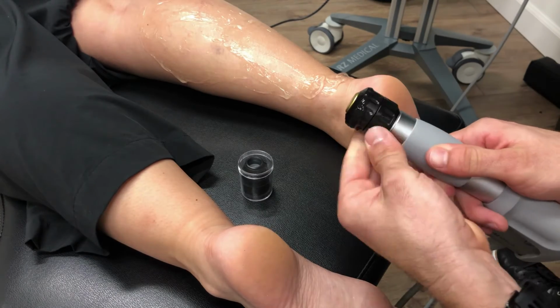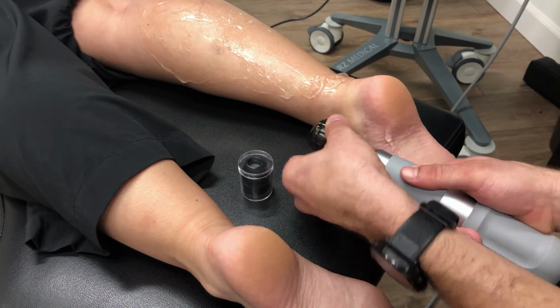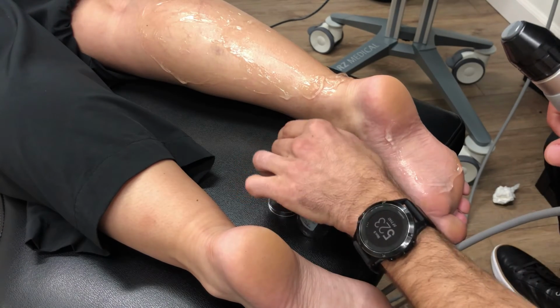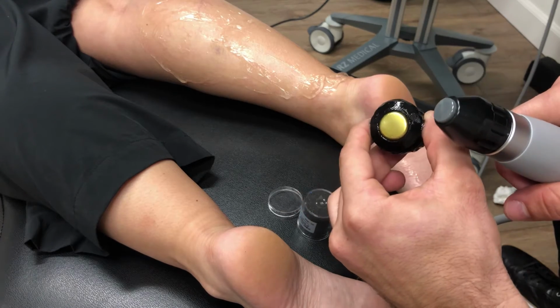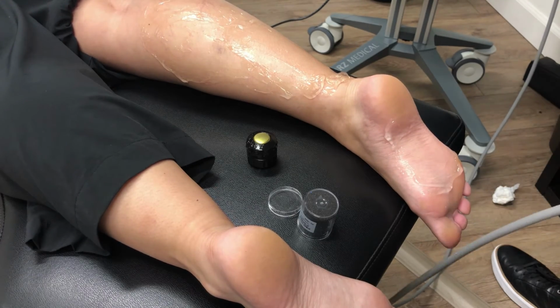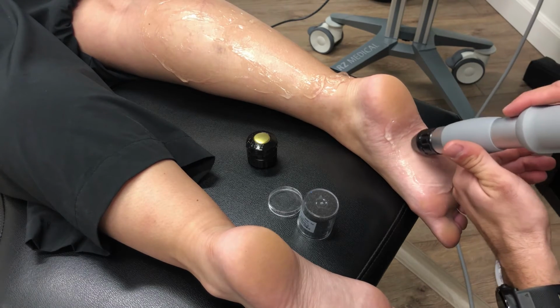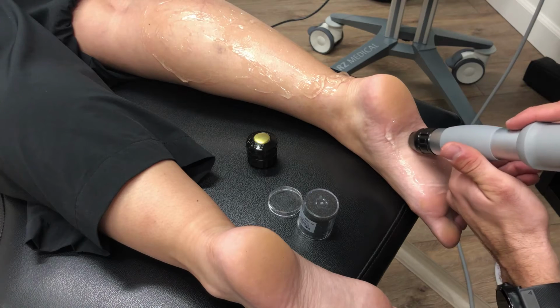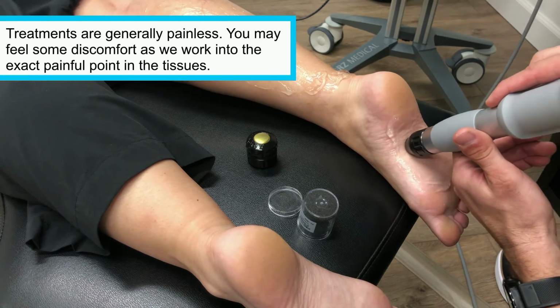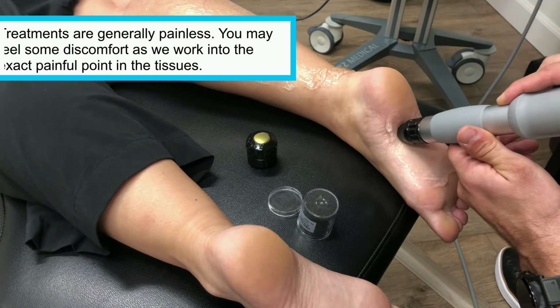So now we're going to swap out the head here. This part has a little bit more of a focused head for the sound waves. And we're going to get right into the actual insertion point of the plantar fascia. All right, Sarah, so I'm going to start over here and I'll work our way into the tender point, and just raise your hand if it gets a little too much, okay? Achy as I get up there? Yeah, right there. Okay.